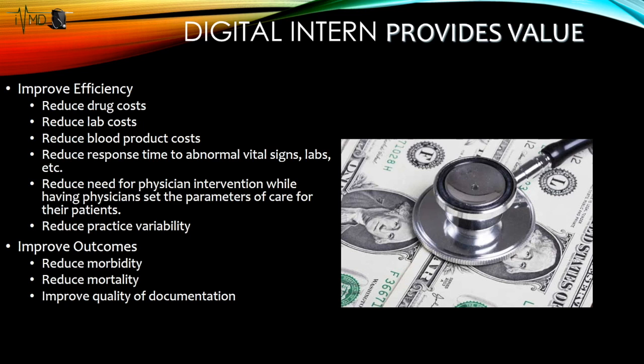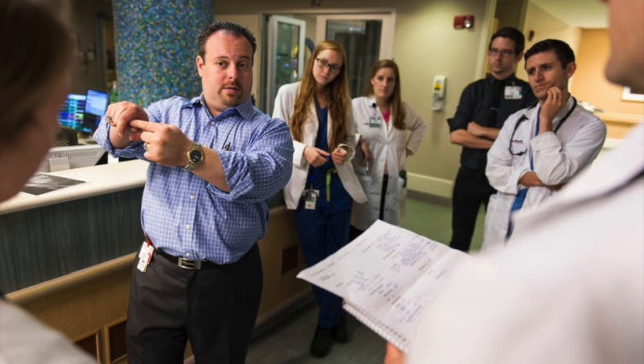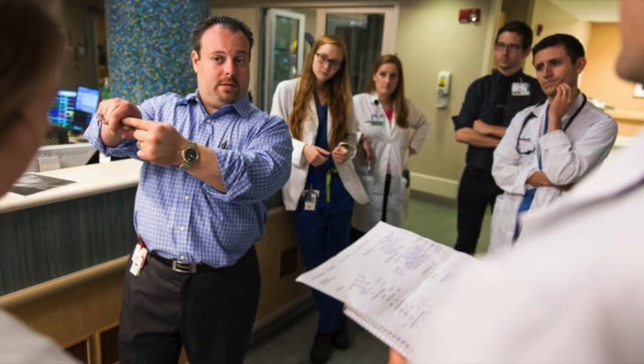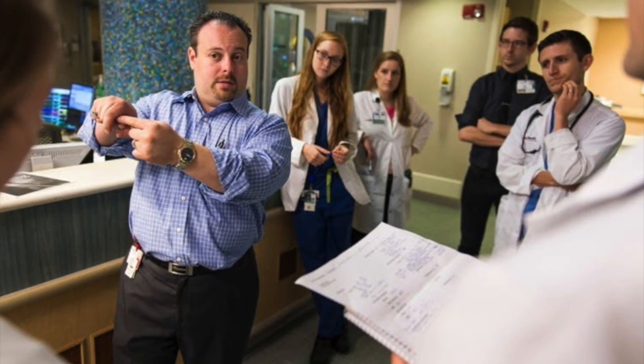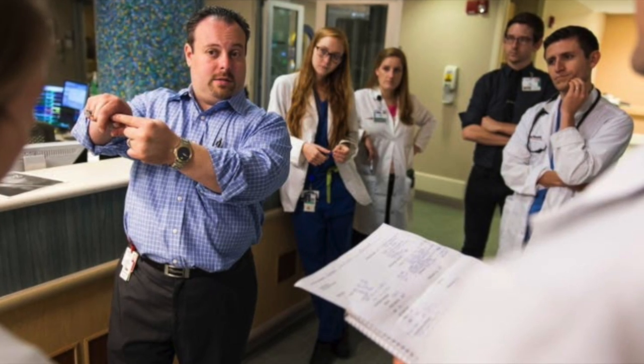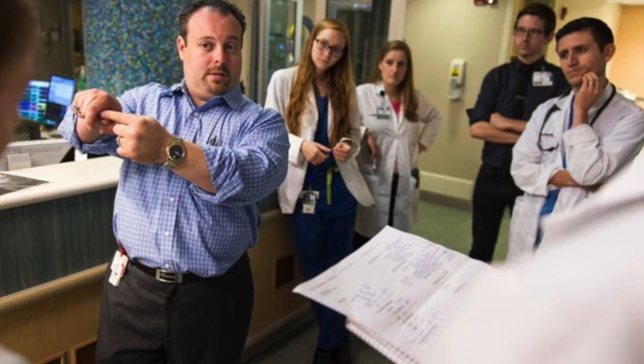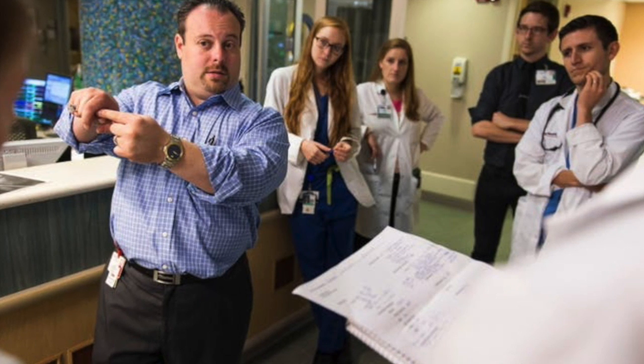of documentation. The Digital Intern interacts with all facets of the medical team, allowing providers to set targets for patients, communicate next moves with nursing and respiratory care staff, and control drug formulary options in a package that adapts to the individual patient's needs while standardizing the approach to patient care overall.